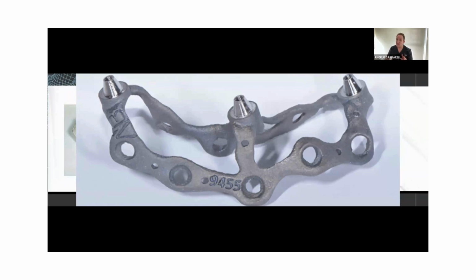The important difference also is in the prosthetic part, because in the past it was impossible to use a screwed retainer restoration. So using the old subperiosteal implant, it was possible only using the cemented restoration. And you know which is the best option in implants rehabilitation, the screwed restoration.